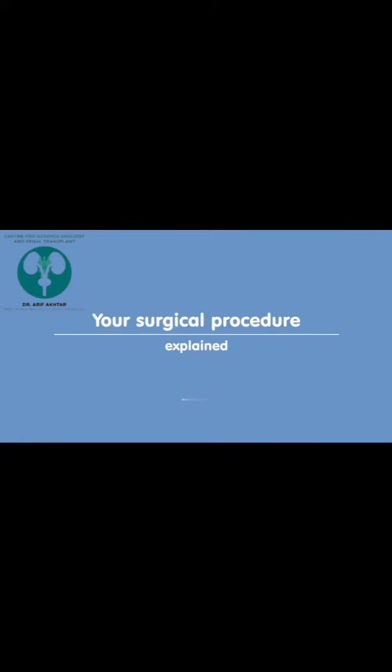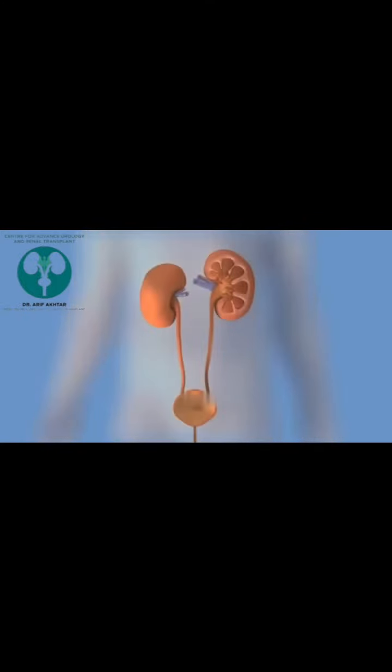Your doctor has recommended that you undergo a ureteroscopy. During this procedure, a ureteroscope with a tiny fibre optic camera is inserted through the urethra and bladder into the ureter or kidney.